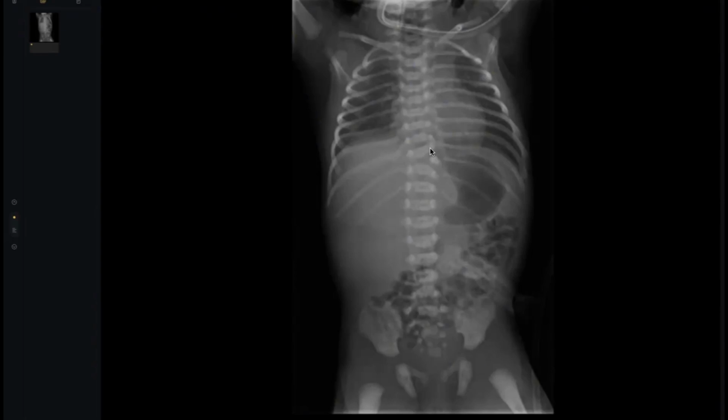I also want to look for any other congenital abnormality, such as the kidney by ultrasound, because it could be associated with a renal anomaly. I will convey the findings to the referring physician, and request an ultrasound of this baby, and a limb X-ray, and also check for anal anomaly, because it's sometimes associated with anorectal malformation.